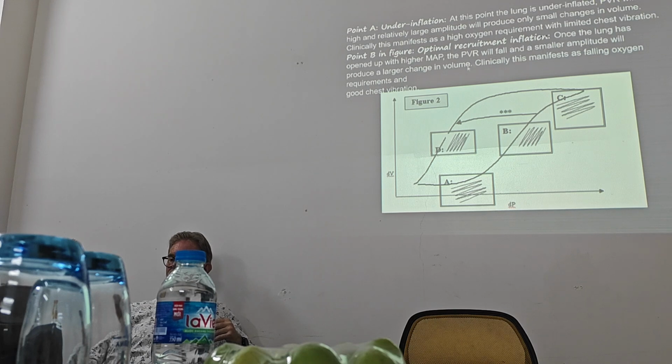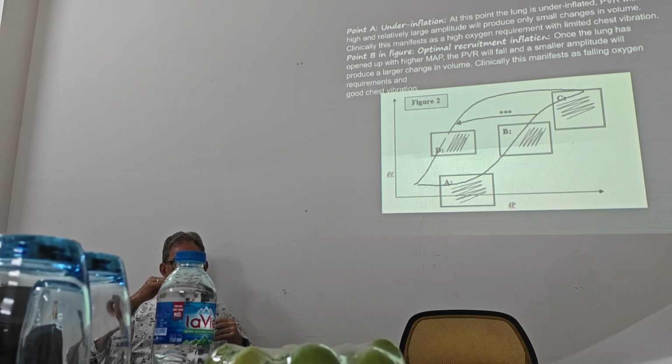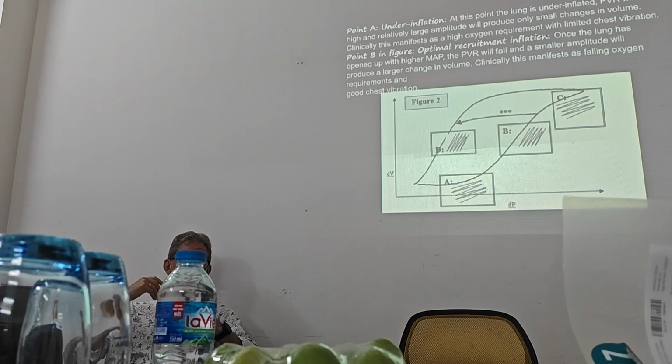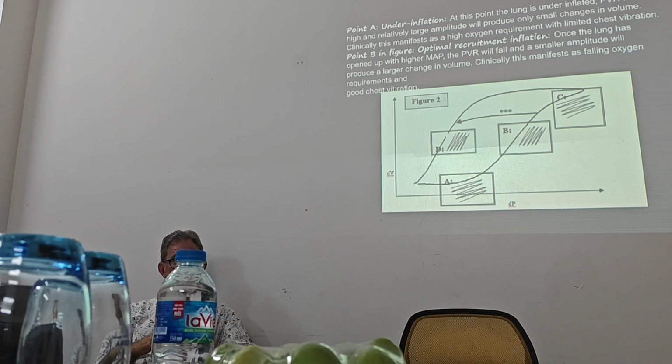What that tells you is you've gone from this part of the curve down to about here. So you're starting to lose lung volume. So what you do is you go back 1 step to where the oxygenation is good, and that's where you leave the mean airway pressure on the oscillator.